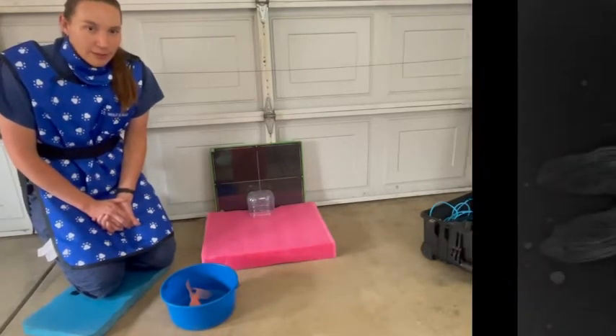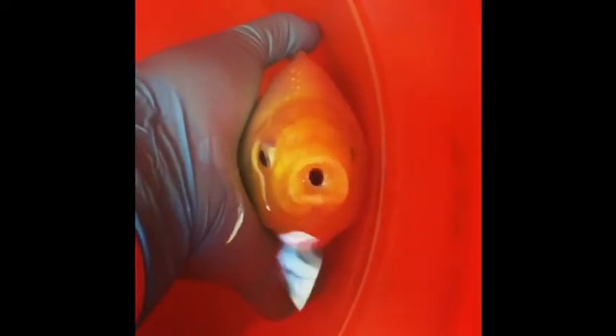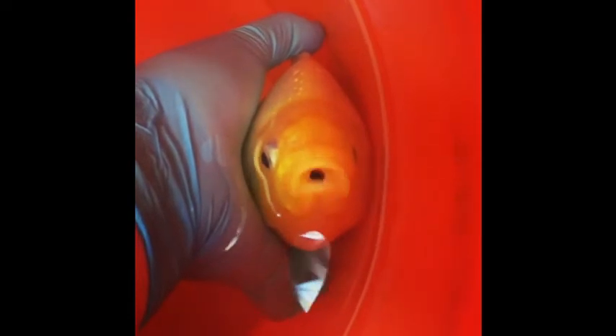This fish presented to our service for a pebble stuck in his mouth. Radiographs were taken to understand if it was just one pebble or multiple pebbles stuck along the GI tract. In this fish it was one pebble, as you can see in the mouth, and he actually had a very unique deformity — in this video you can see there is actually a flap of skin that was acting like a one-way valve preventing the pebble from escaping.